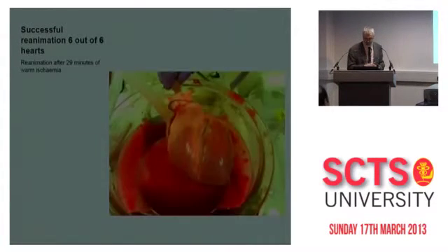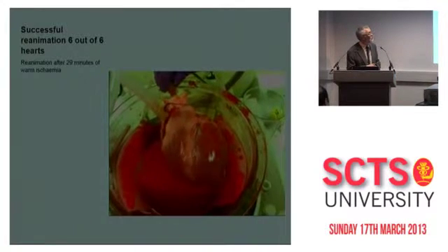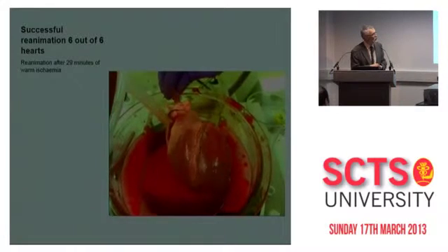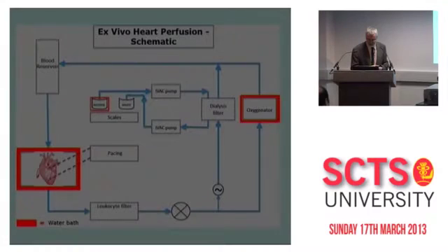worked afterwards. This is a heart that had 29 minutes of warm ischemia, and that was, I know, looking at some of these things, I wouldn't fancy myself. I don't think they work brilliantly, but they're not too bad considering.